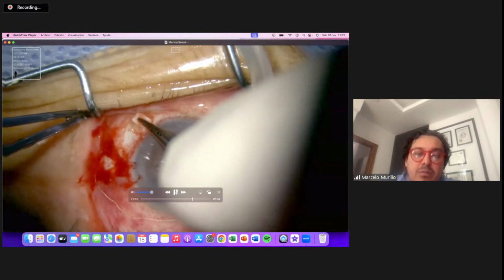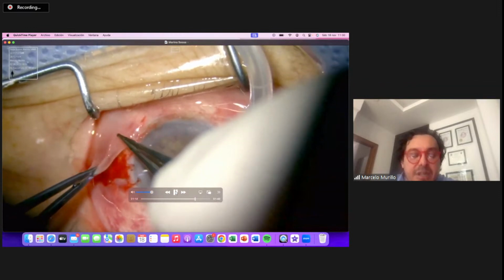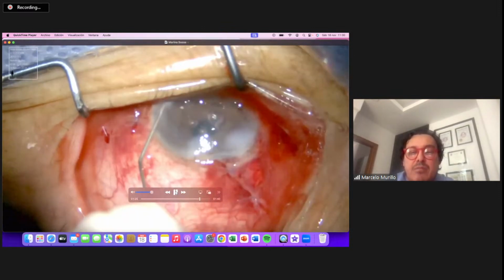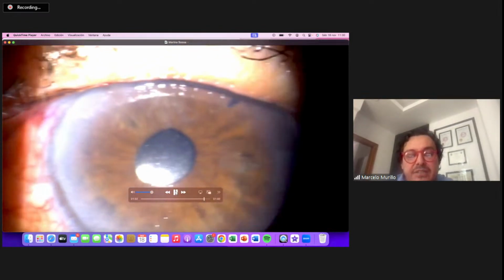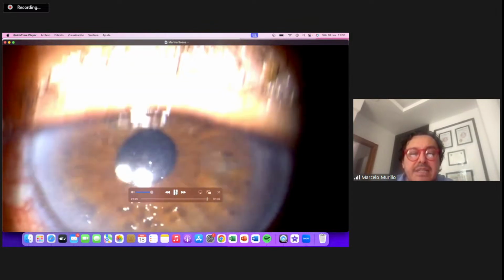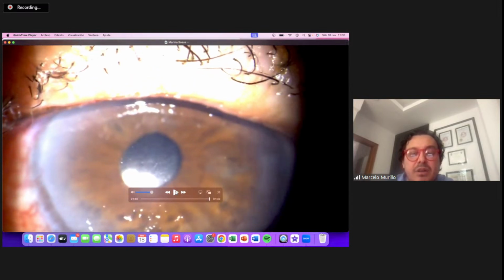And we know that there's no perfect technique. We are looking and searching for the best techniques in these patients. We know also that in the future we need a more consistent technique to offer kids and these patients. This is a post-op, 1 week, I believe. There's no tilt in the lens, so the patient is going well. So that's the technique. Thank you.